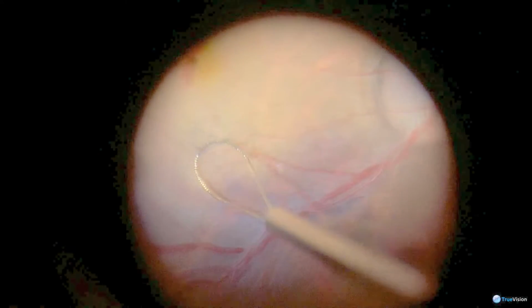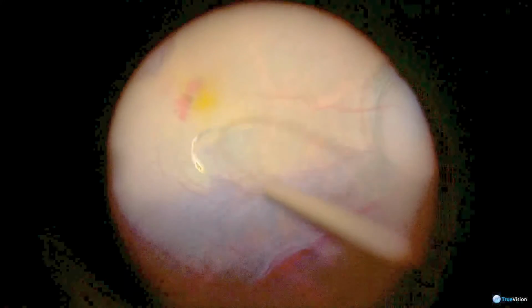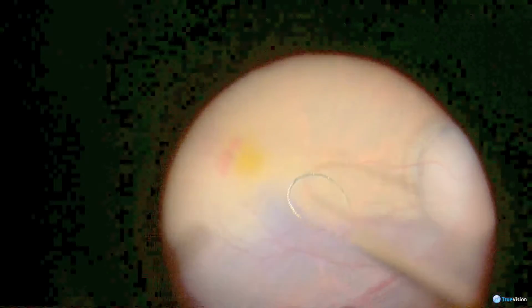The little areas that actually engage are flexible enough to remove the ILM with just a little bit of action there. It's also important to realize that the loop can be adjusted, so to increase the stiffness, the loop can be shortened, which is useful to remove an epiretinal membrane, say, but to remove the ILM and to have more flexibility and less stiffness, that loop can be widened. So it gives that flexibility of either making the loop quite stiff for an epiretinal membrane, for instance, or fairly flexible for the ILM, and I find that very useful.